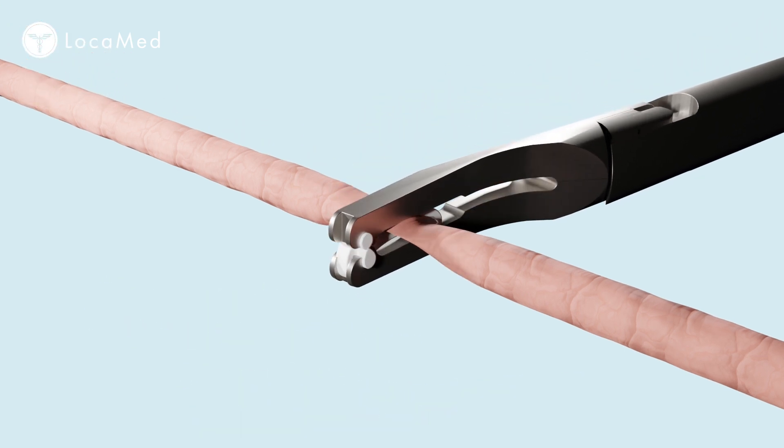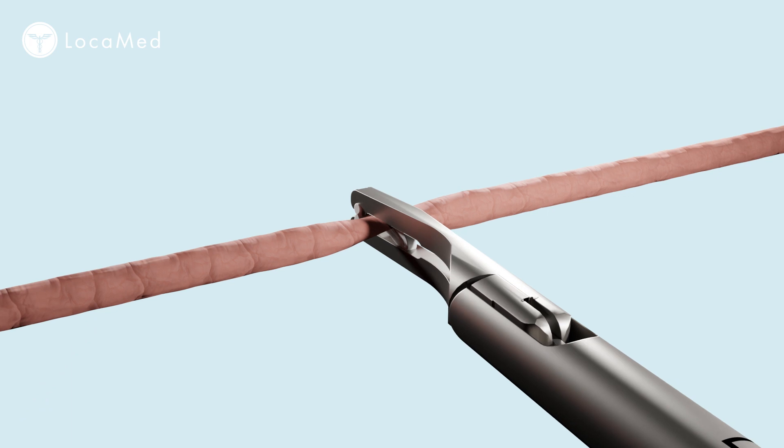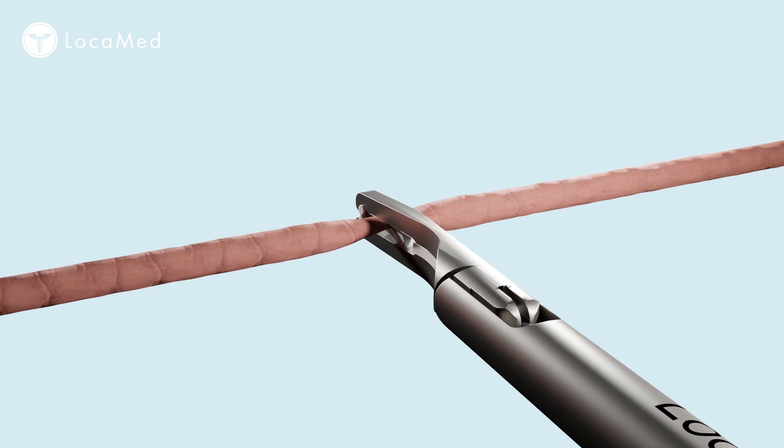Close the jaws under direct visualisation. You will feel a click as the locking mechanism engages. If the locking mechanism does not engage, there may be too much tissue within the clip and a larger clip is indicated.